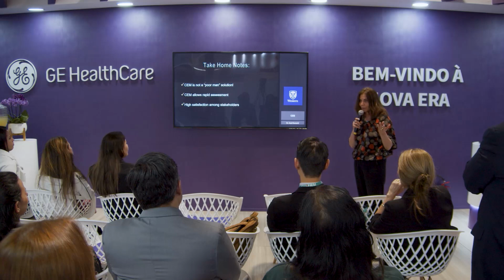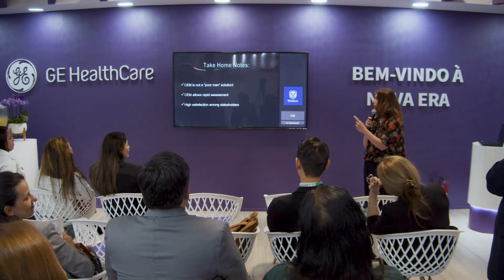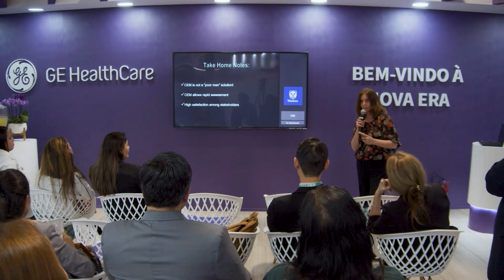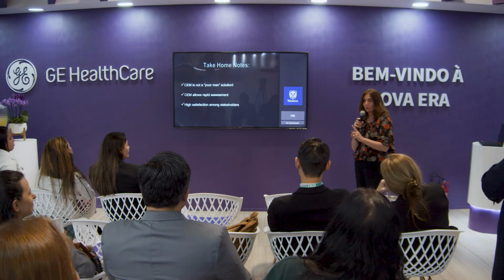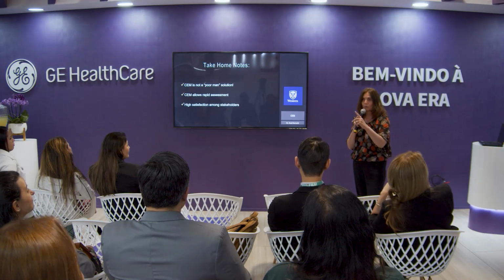It's not like you have unlimited spots for MRI. The rapid assessment is a huge thing. And as I mentioned, high satisfaction among our stakeholders. In fact, our surgeons and oncologists won't see a patient if they don't have contrast mammography as a baseline, because they monitor for treatment, they monitor for surgery, for everything. So they always get it, even if it's a fatty breast.